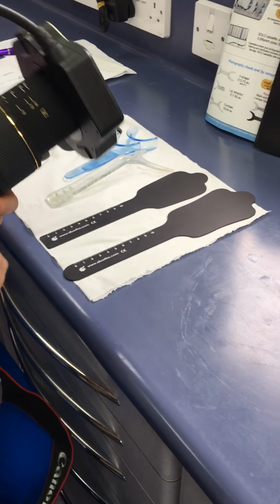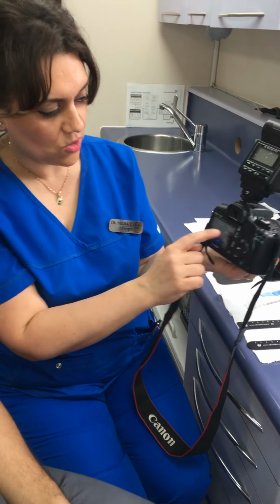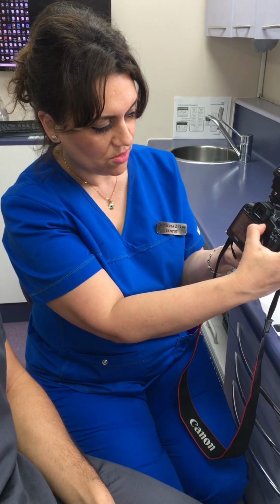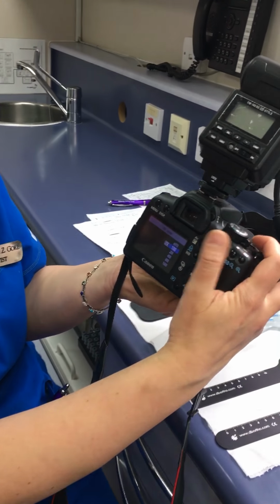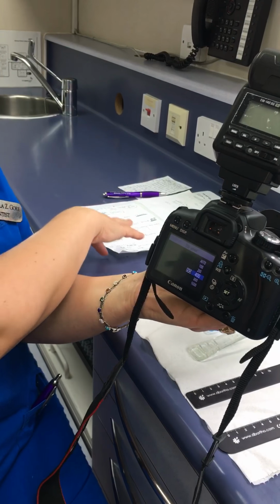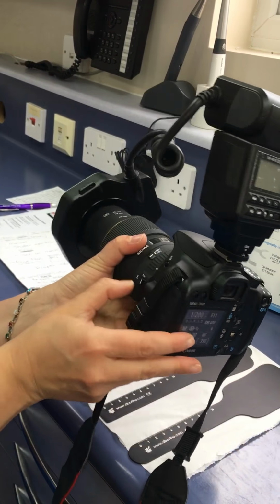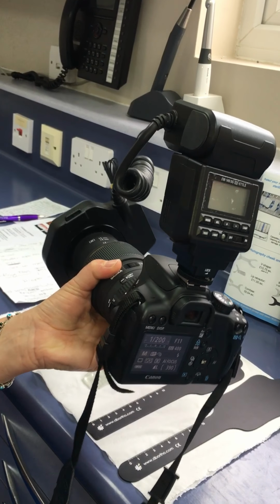If you're taking a portrait photo, what do you set it to? F11. So that one will change to F11. Would you change anything else? The ISO to 400. So you press that and you just change it to 400. What else do you change? And you put it on autofocus. Do you know where autofocus is? It's here. You press that on autofocus. This way you don't need to keep changing the magnification ratio.